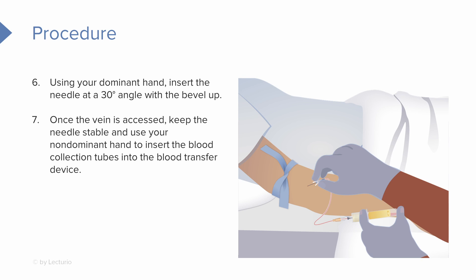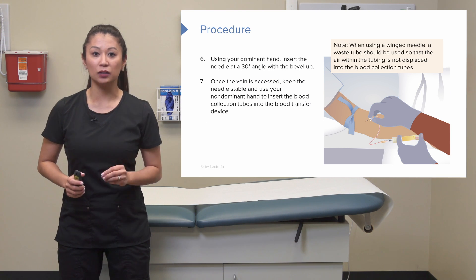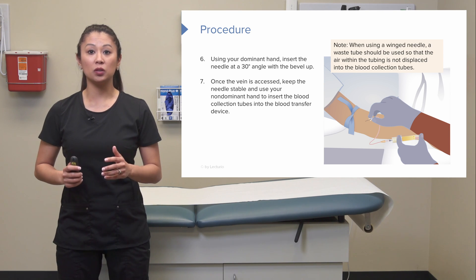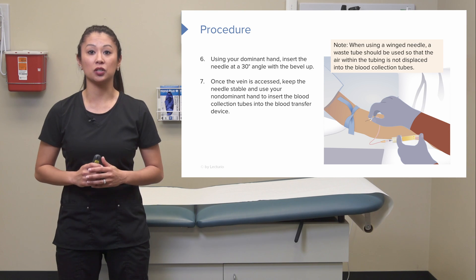Once we access that vein, keep the needle stable. Then we can use our non-dominant hand to insert the blood collection tubes into the blood transfer device. When using a winged needle, a waste tube should be used so that the air within the tubing is not displaced into a blood collection tube.